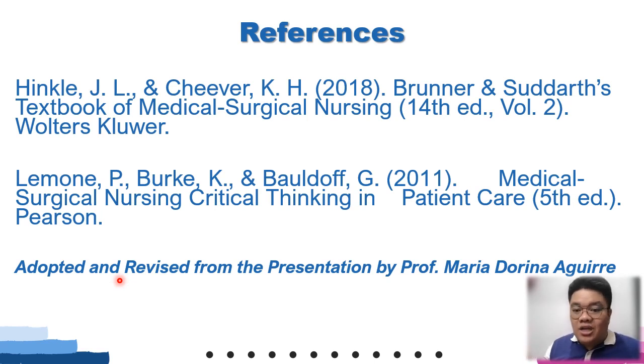Class, for you to pull it out, what you need to do is detach first the asepto syringe and then push the blue bulb, attach it back, guys, and then that will give you a sucking action towards the asepto syringe because of the negative pressure. And then that's it. You're done with your irrigation for that matter.